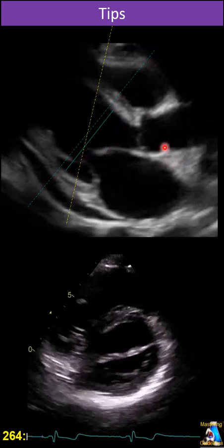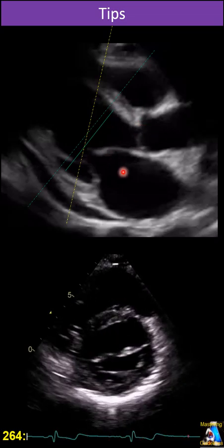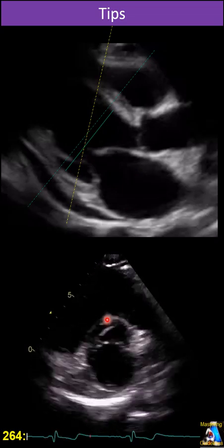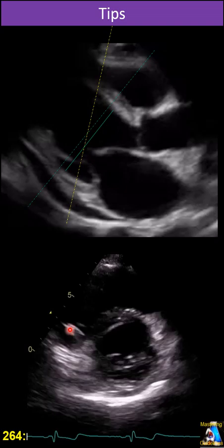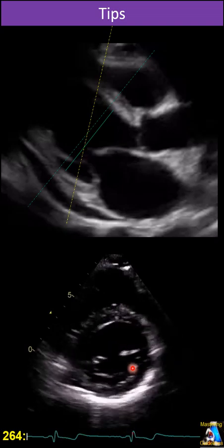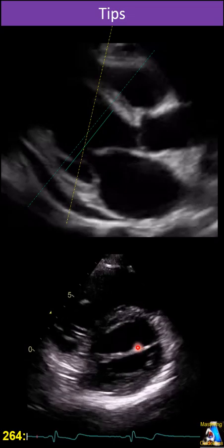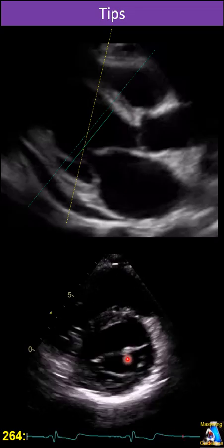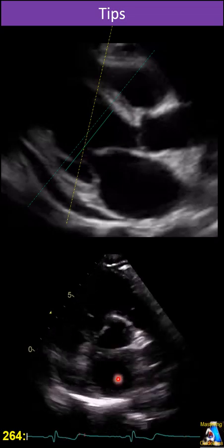Generally, systolic is not a good idea on the PLAX. But instead, we can do those measurements in the short axis, 2D or M mode. That will be much better for many reasons. First of all, you have to make sure your view plane is between the tip of the mitral valve, the fish mouth, where you can see the anterior mitral valve leaflet suddenly become a little separate, meaning you are beyond the tip of the mitral valve, or completely lose it and see just part of the mitral valve leaflet. That is your view up to the papillary muscle.